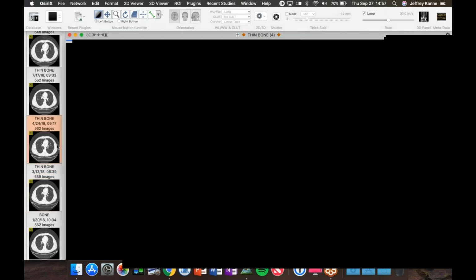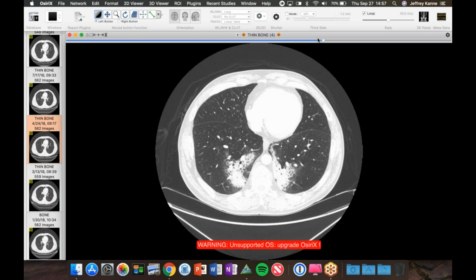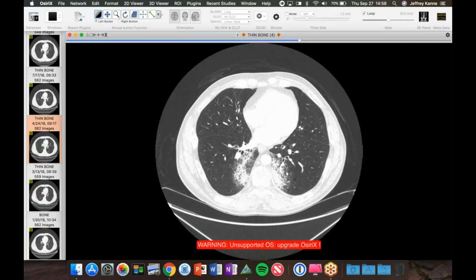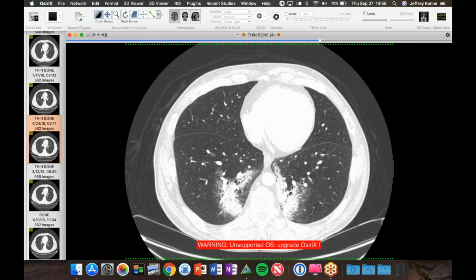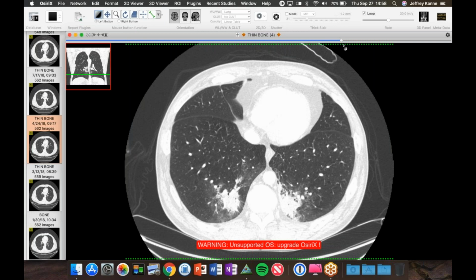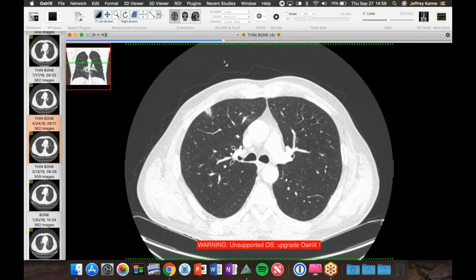So that was March. Now we jump ahead about 6 weeks. So patient's back for more surveillance, and you can see it's becoming more exuberant, which we typically see with radiation. But it's really taking on an organizing pneumonia-like appearance. It's crescent-like. You can see it perilobular distribution. And then started to get a few areas in the right upper lobe outside the treatment field.